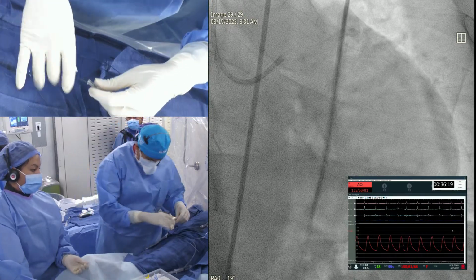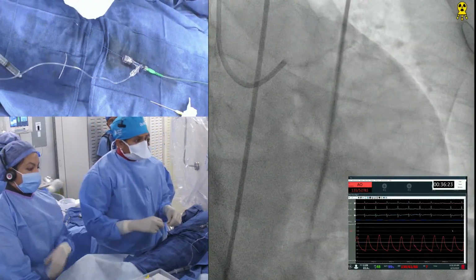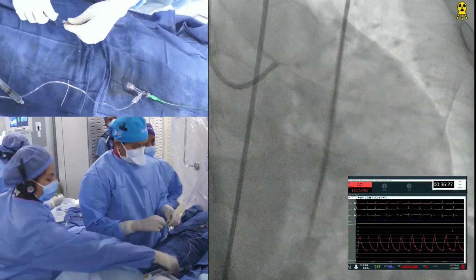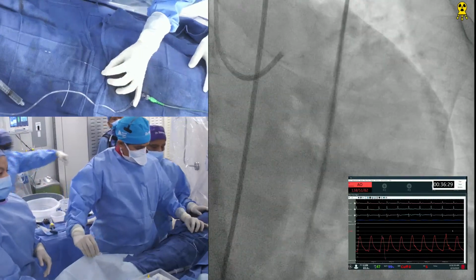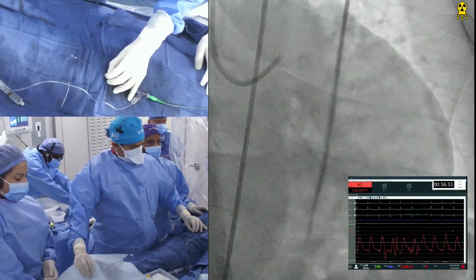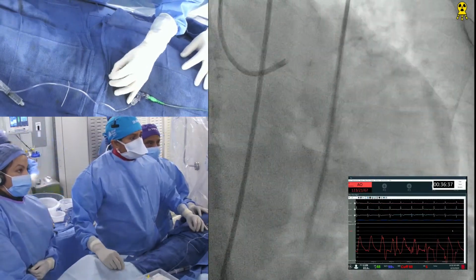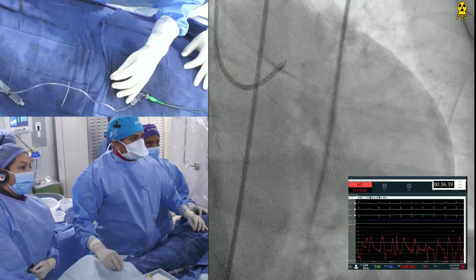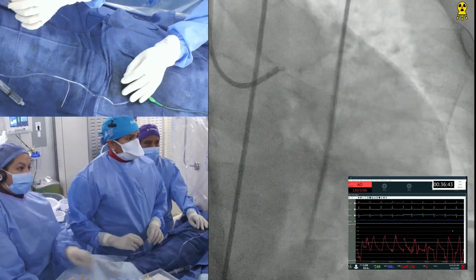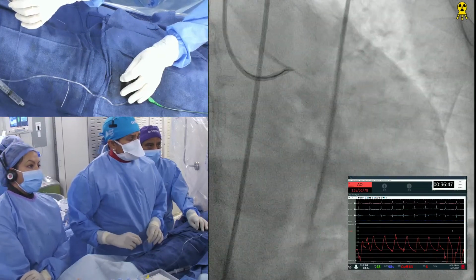EDP was okay, 15, so. So we're changing there. Let's see. It's not. Good. Too far. No, wire. You have to put your wire first. Wait, not to worry.